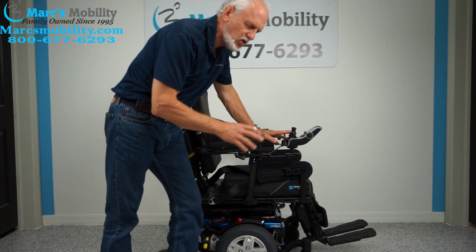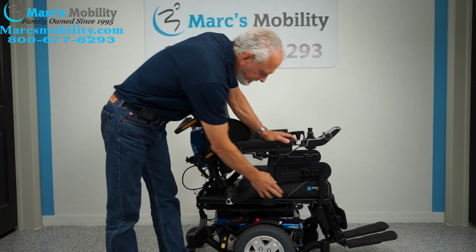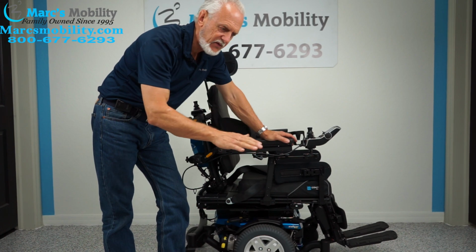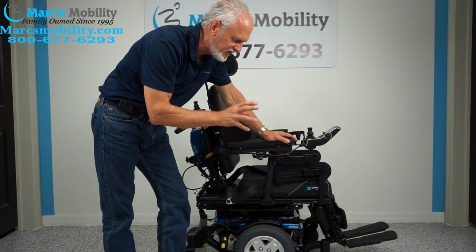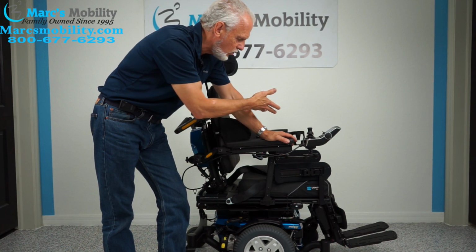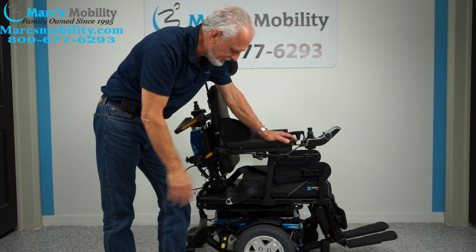This chair is supposed to give you around 15 miles on a battery charge. But folks, 15 miles, it all depends what kind of surface you're on, how heavy the user is, if you're going uphill in the grass, and how many of the functions you're using. So the 15 miles could be 10 miles. Or if you're not using any of the function and you're lightweight, it could be 18 miles. So that 15 miles is just a gauge, okay?